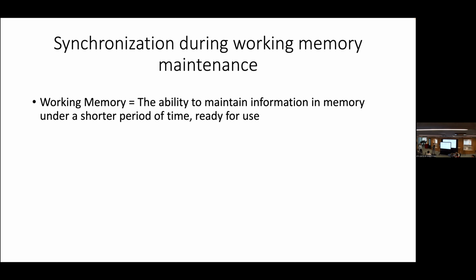All right, so that's what you showed. They get stuck for a lot of time, and then you just have some bursts. So if you ask whether these oscillators are synchronous, and you just take the phases and put them into a PLV, for example, the answer is always yes, because even if the bursts are at completely different times, most of the phase is always at the same place. But you are not interested in that. You want to see correlations between them. So these kinds of tricks are necessary at some point if you want to disentangle this.